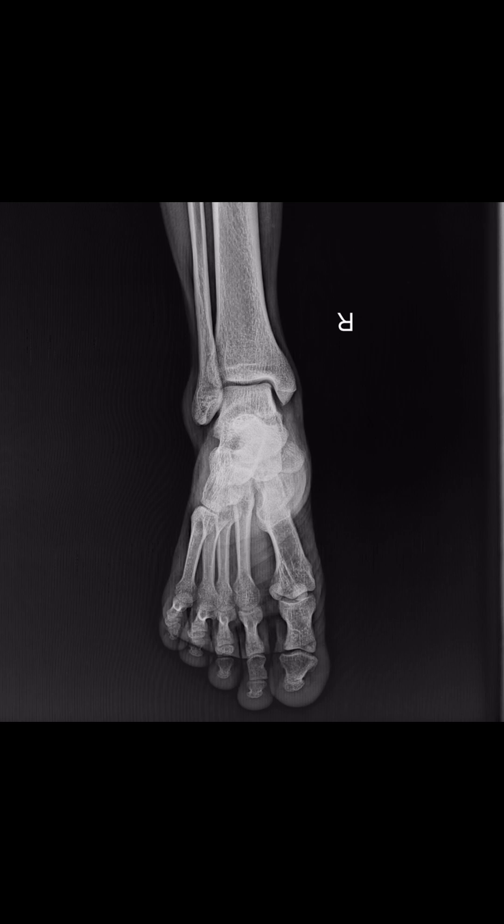The first thing I look for is the alignment of the tibia, the fibula, and the talus, which looks perfectly normal to me. There is no shift or tilt of the talus. Secondly, I look for the joint space, which looks healthy.